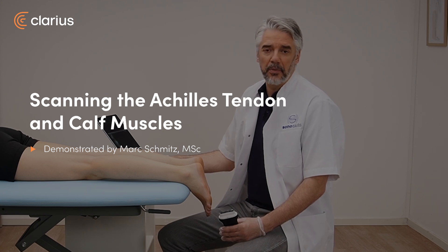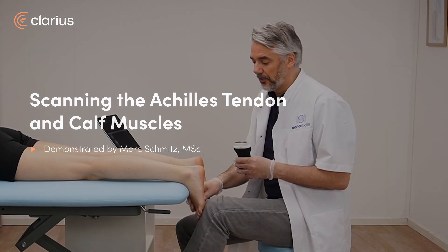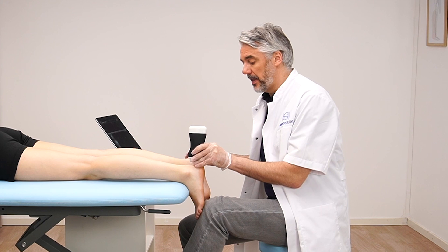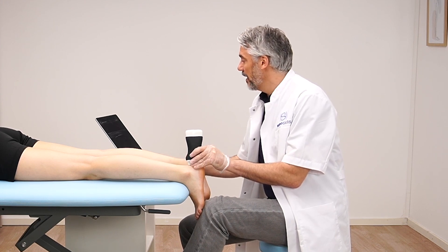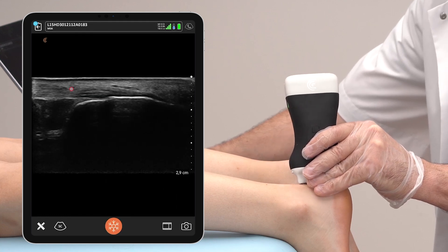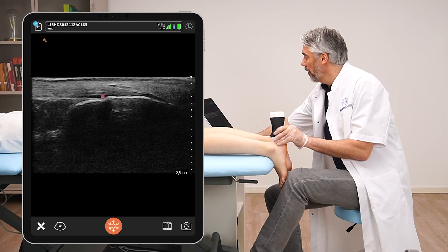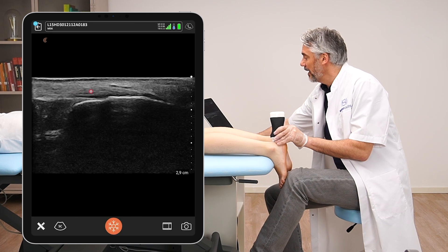To scan the Achilles tendon and calf muscles, the patient is in prone position with the foot in relative dorsiflexion. Placing the transducer on the calcaneus, we can see the calcaneal bone with the fibers already inserting into the calcaneus. Please observe the thickness of the Achilles tendon — you can clearly see the fibrillar pattern and that the bone is regular.